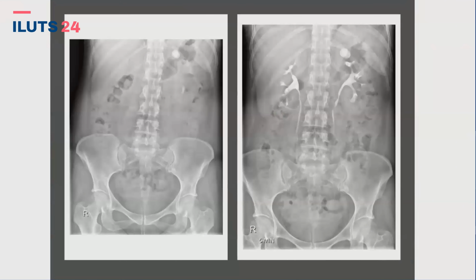This clinical case is interesting because it's somehow related to your case, Danny. So look at the left kidney. We can see that we have stones on the inferior calyx, and we have clearly a diverticulum in the superior calyx. And as far as we can see on the pyelography, there's no connection between the collecting system and the diverticulum. So, your approach, Alberto. First approach.